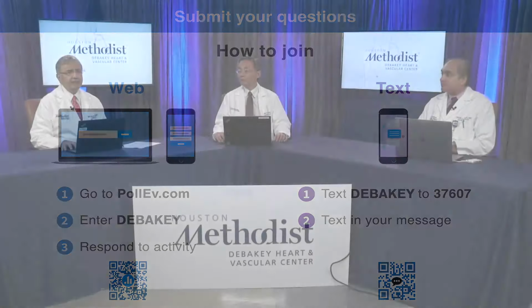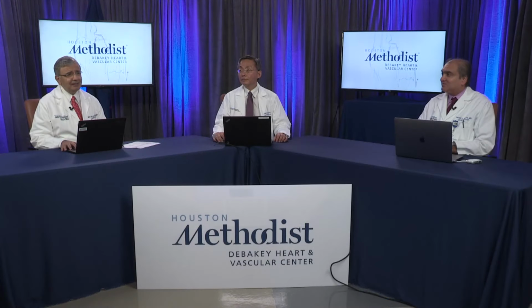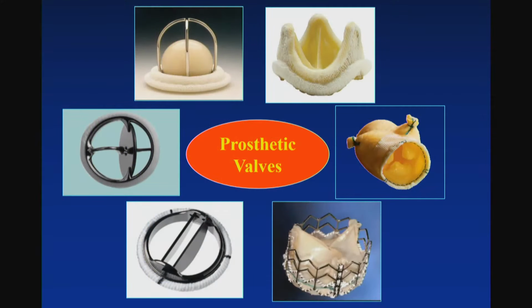I will start with echo Doppler. I'll take the prerogative of the chair and spend a little more time than our friends in CT and MR. But truly, because echocardiography, I think all other modalities would acknowledge, is actually the first line of evaluation of patients after they undergo replacement or repair nowadays of a valve with a prosthesis or a catheter-based repair.